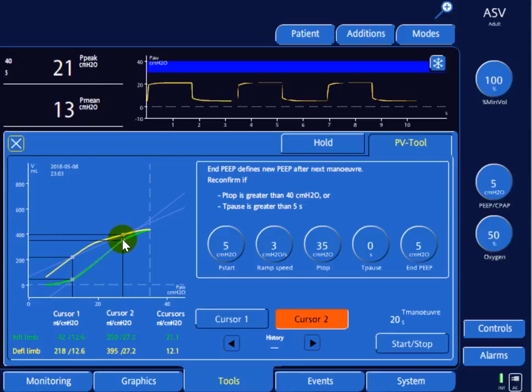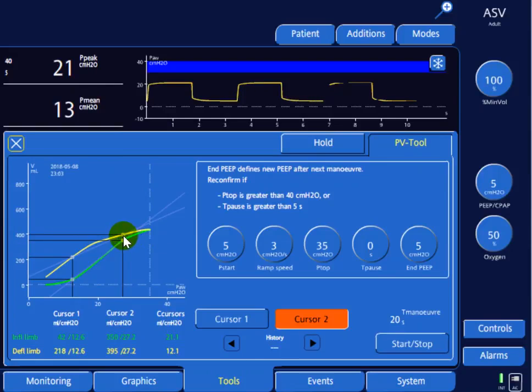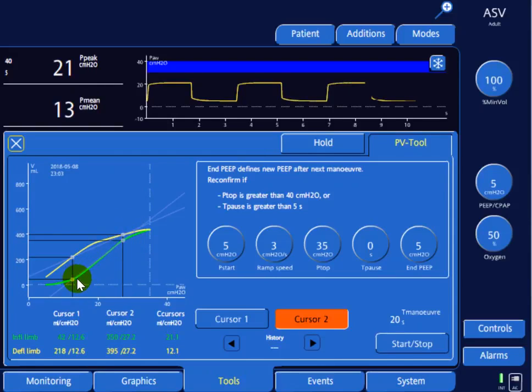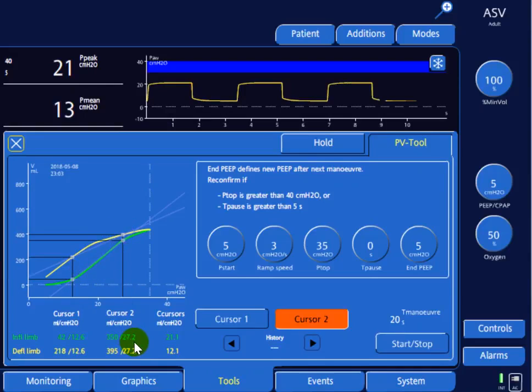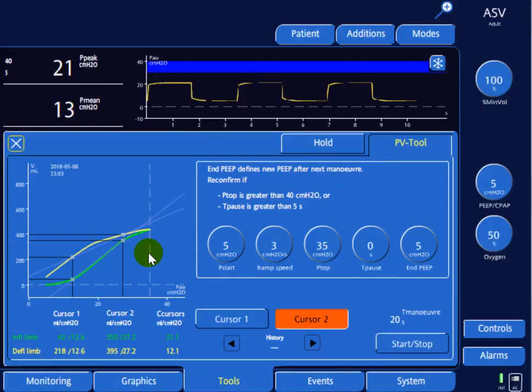Looking at the upper inflection point at around 27 cmH2O — going above this pressure yields very little additional tidal volume, at the expense of potentially injurious high pressures. So the patient should be ventilated between a PEEP of 15 and a plateau pressure of 27 to 28. That gives a driving pressure of 28 minus 15, which equals 13 — optimal for an ARDS patient. This tool can also be used to recruit the lung, which will be covered in a separate video.